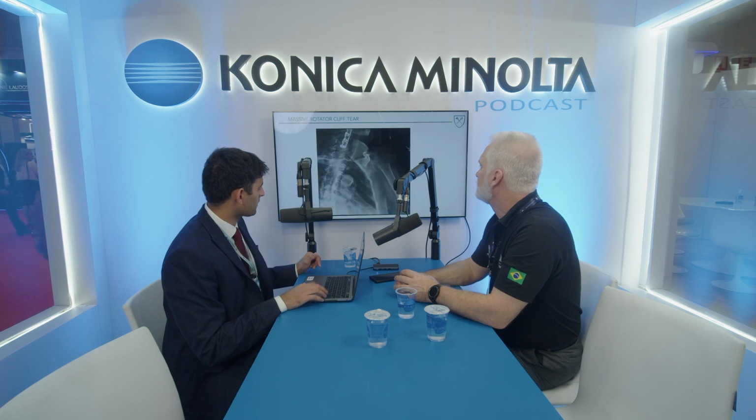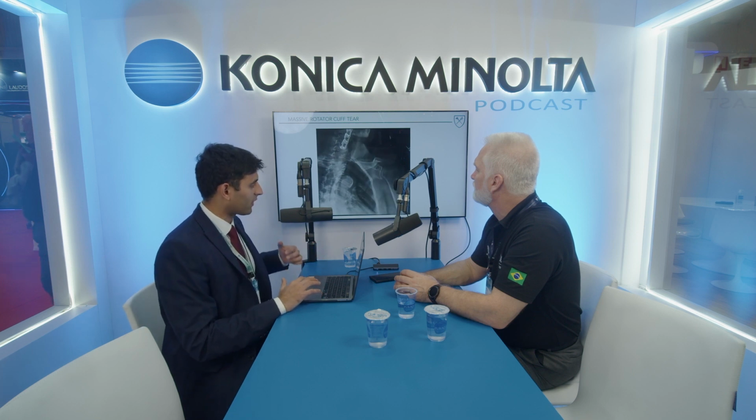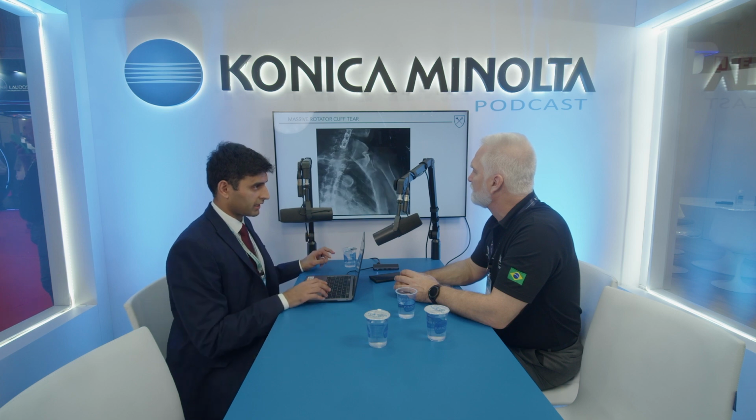So again, this is another patient with the same problem. The patient is what we call pseudo-paralytic. They're unable to move their arm because of a massive rotator cuff tear, which you can't tell from a static radiograph.